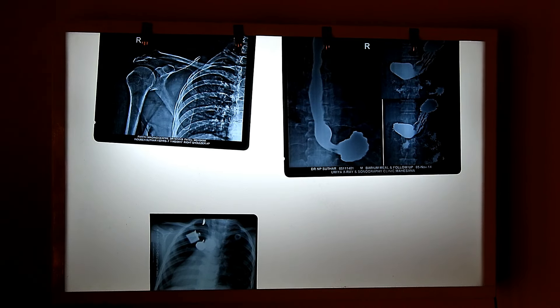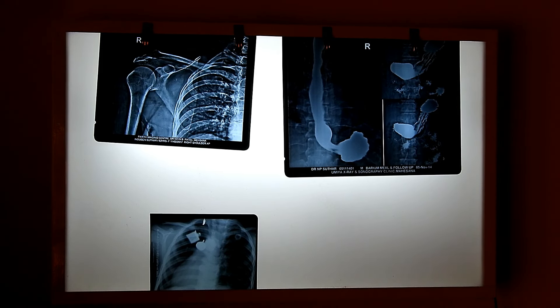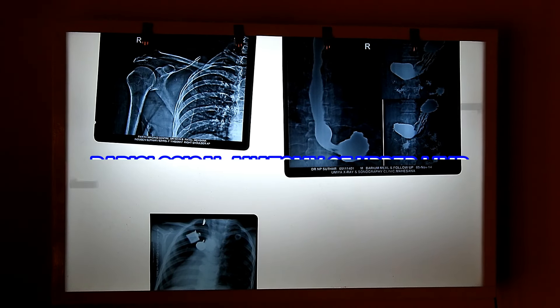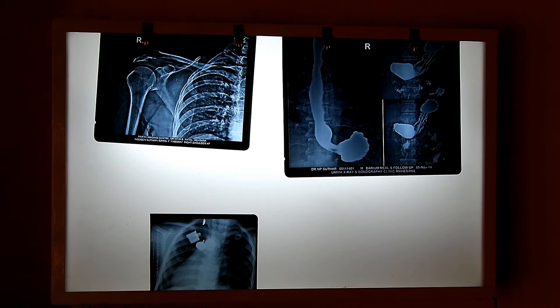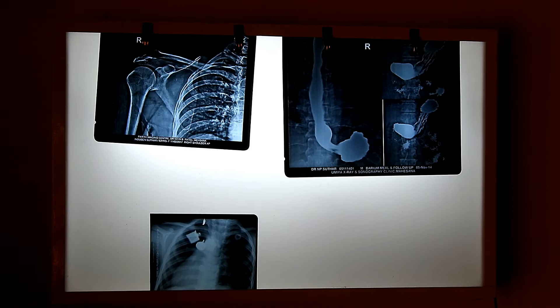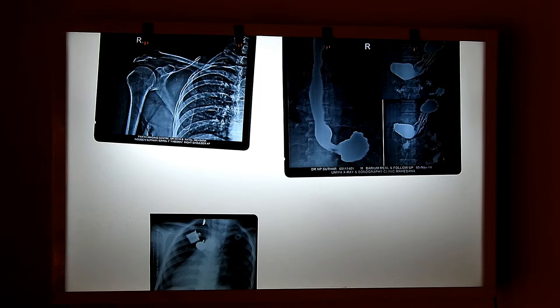Hello friends, welcome to the Biobarbos of Anatomy. Today we will discuss the radiology of the upper limb, but before that we will see how to read a radiological film.